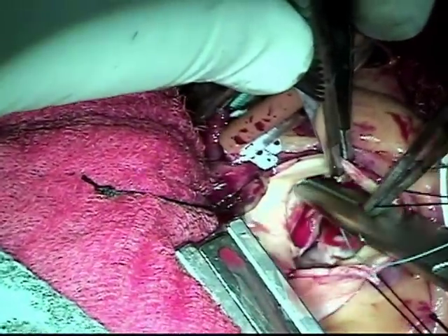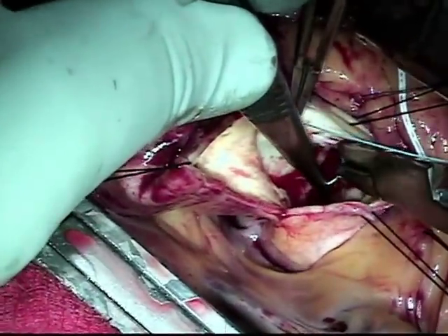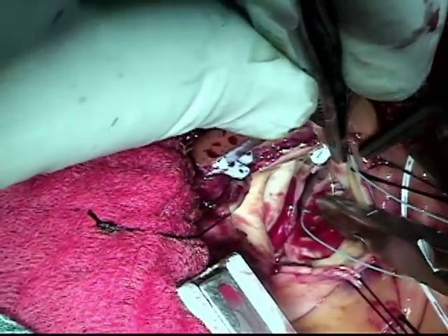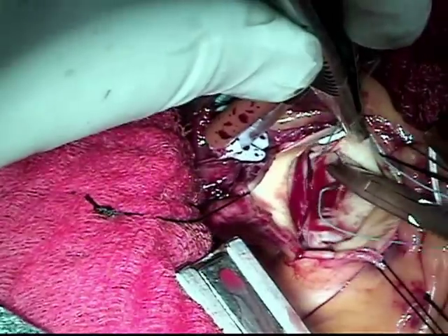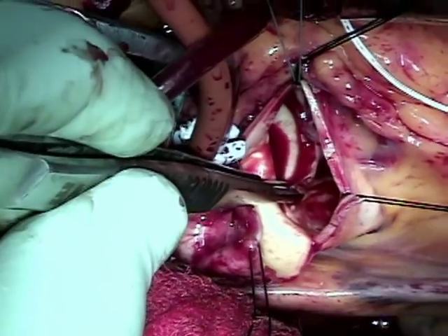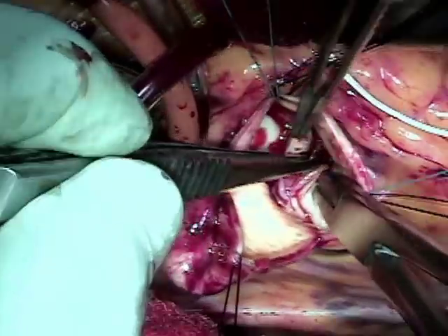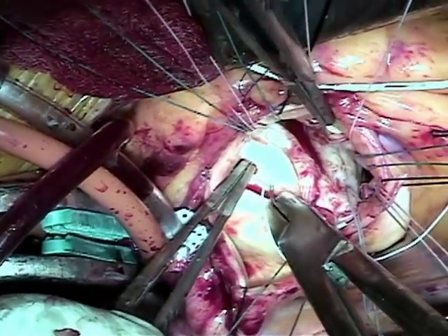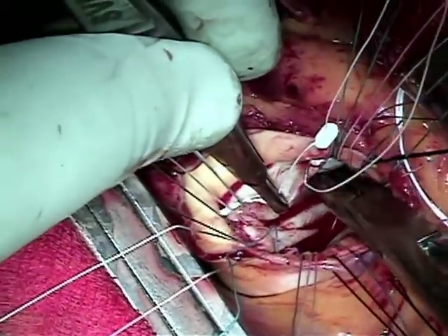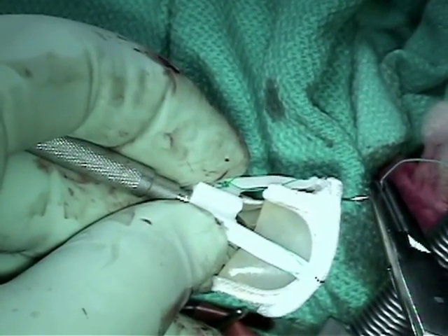I like to put the pledges on top of the annulus. I believe that results in better hemodynamic performance of valves and it certainly results in less leakage around the valve — perivalvular leak. That's the main reason for putting the pledges on top of the annulus. That first suture was at what we call the right-left commissure, and this is at the non-coronary and left commissure, and finally the sutures are being put into the left annulus.